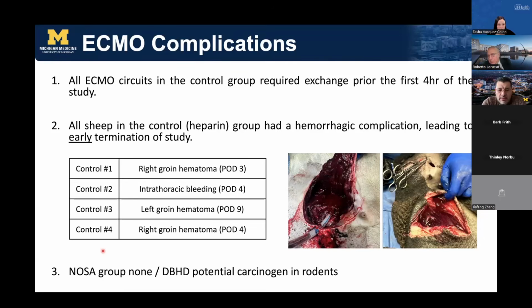So right now, my team, led by Dr. Launer Sorba Orsi, who I think is in the webinar, and collaborators in chemistry and pharmacy developed a new NO donor called SNAP, where she's able to impregnate and swell ECMO circuit components with great success.